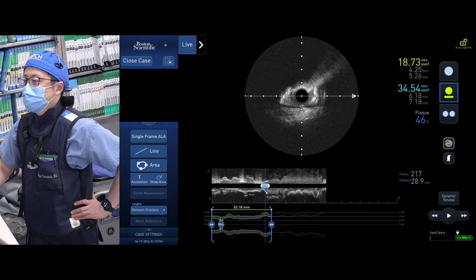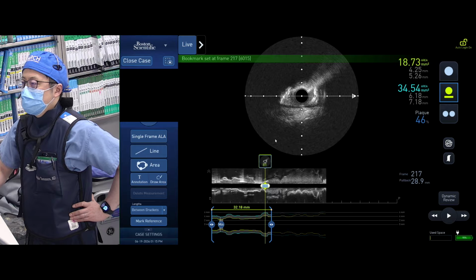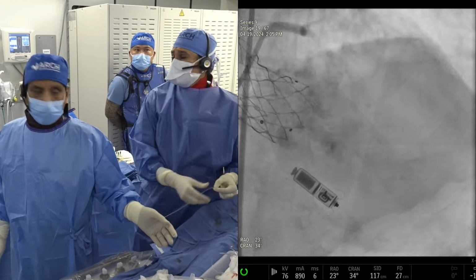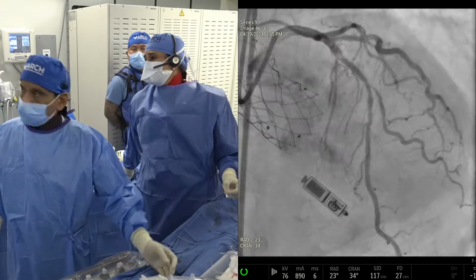And the biggest question will come, what everybody thinks about the diagonal. Look at the very big diagonal. So go back to angiogram now. I think this is okay now. We understood. We'll come back, Kiski. Yeah. Wait 1 second. At the level of the diagonal, Kiski, give us the CSA, the MSA of the LAD. It's 360 calcium at the level of the diagonal.